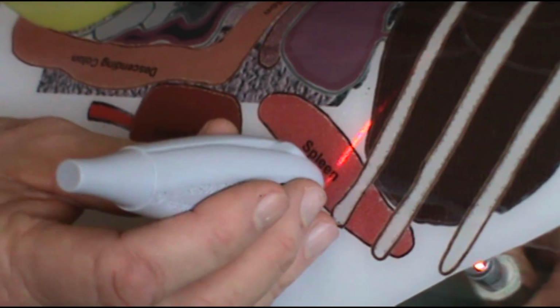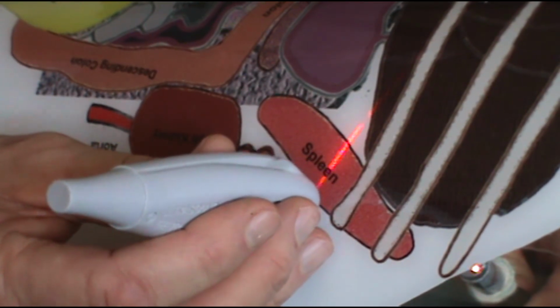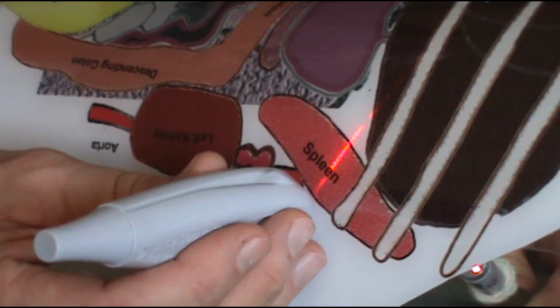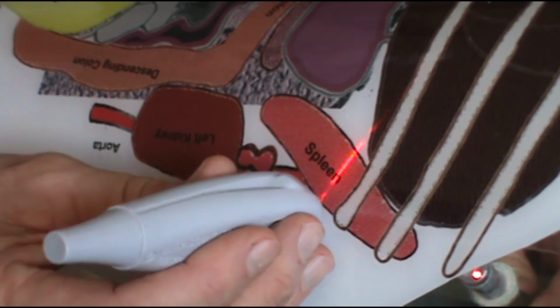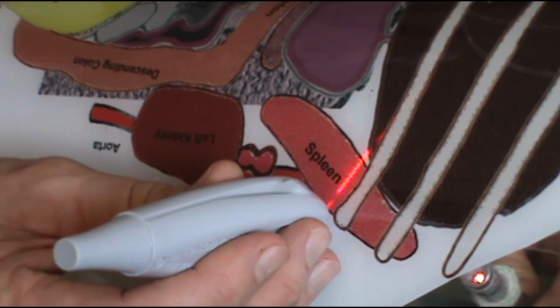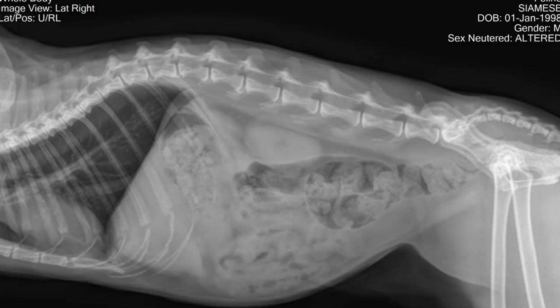When finished examining the spleen, the transducer is in an off-sagittal position on the left lateral abdomen and caudal to the last rib. In dogs and cats, the left kidney is usually in a very dorsal location, caudal to the last rib. Remember, the kidneys are retroperitoneal. That is, they are outside of and dorsal to the abdominal cavity, near the last rib.